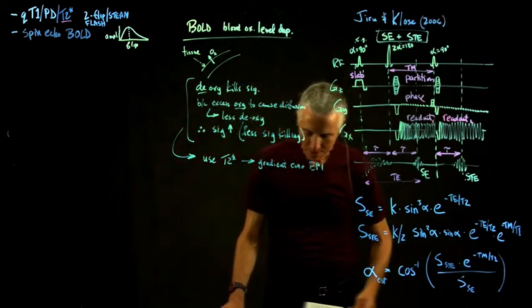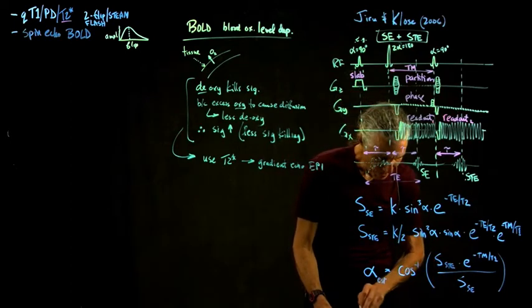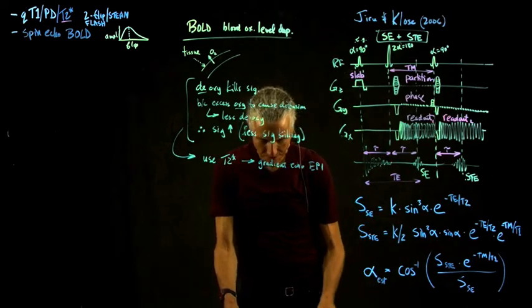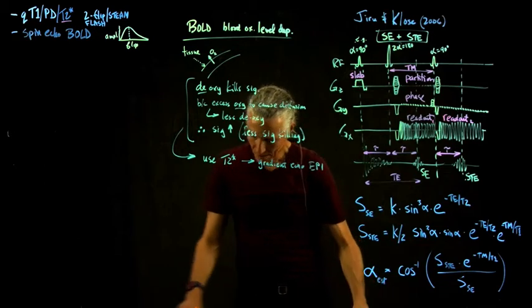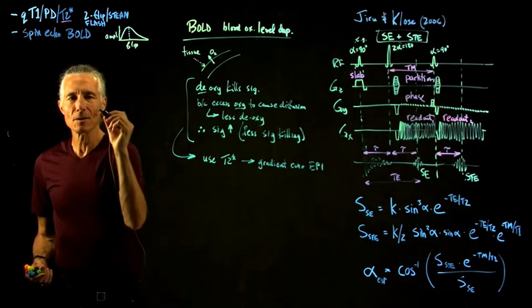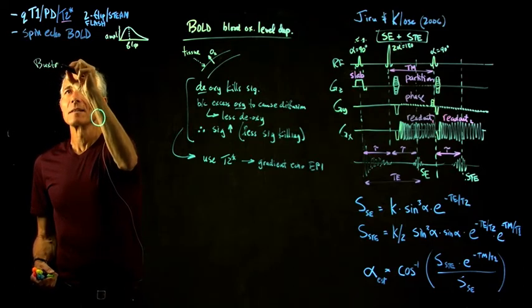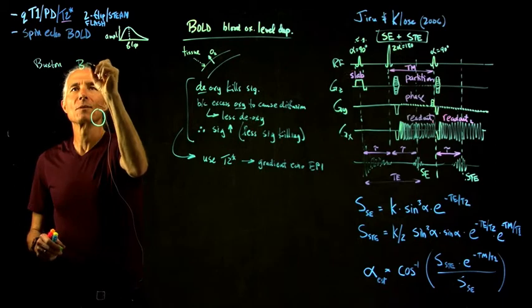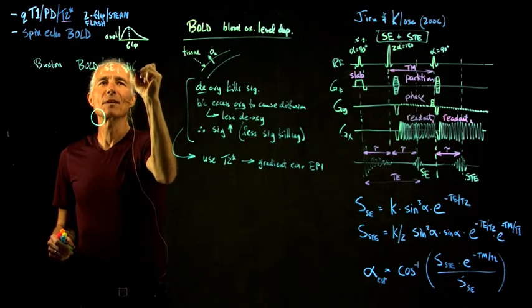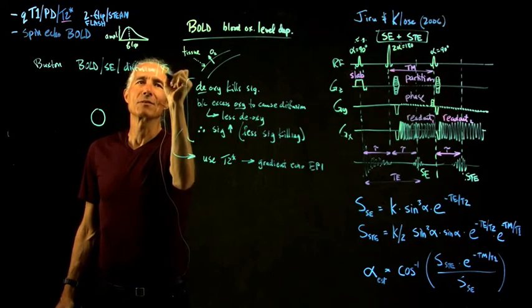And so the argument is, well, we might want to do it because of the following argument. If we have a large blood vessel, this is an argument from Buxton that combines BOLD, spin echo, and diffusion. We haven't talked about diffusion yet. BOLD, spin echo, diffusion, T2 star.